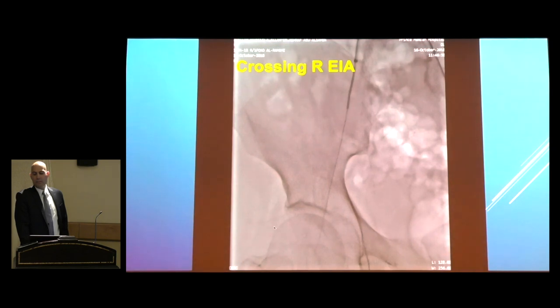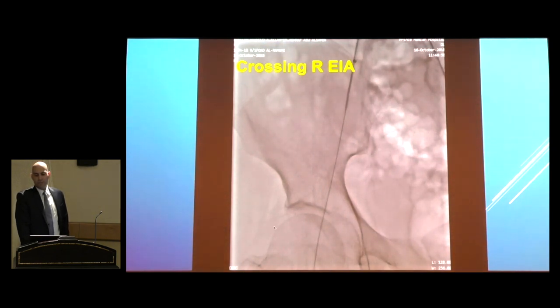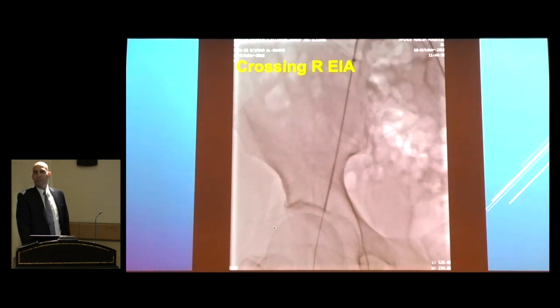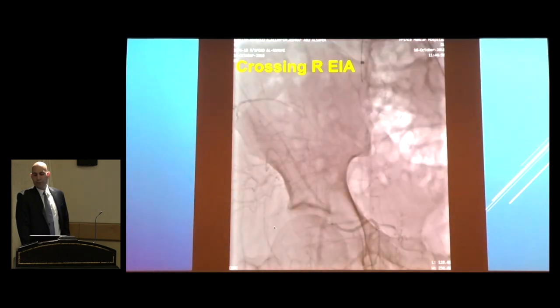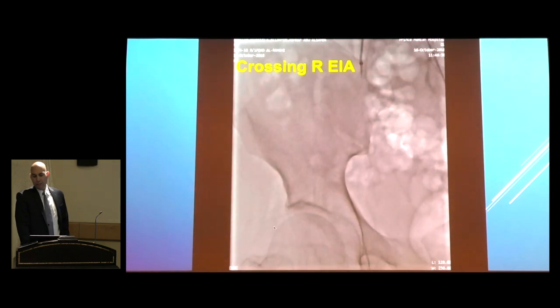The wire slowly made its way distally with the support catheter following it. The wire did not loop but obviously turns through the occlusion. Here it's going down with no resistance at all. I advanced my catheter down and confirmed entry into the common femoral artery. After pulling the wire out, we confirmed we were intraluminal in the broad common femoral artery.